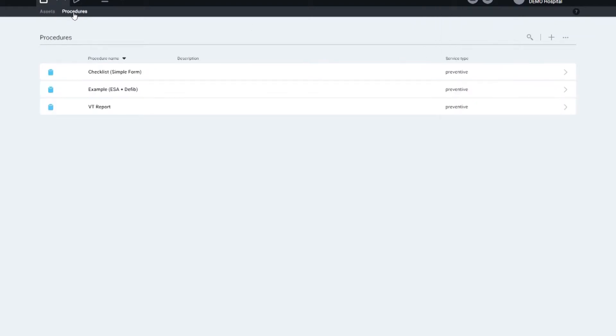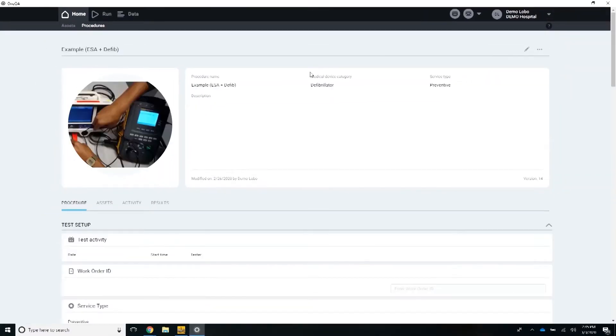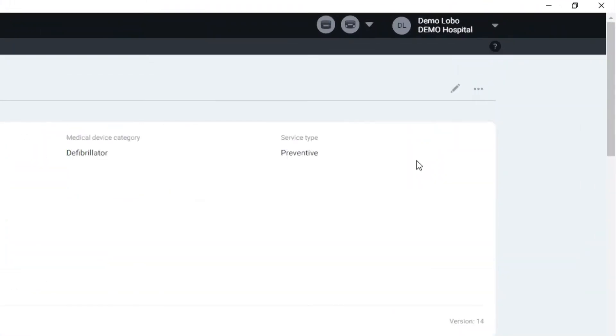Then I go to the procedures tab and download all the sample procedures we have in our library. You can select any procedures just to see. In the top right here, I select run procedure.